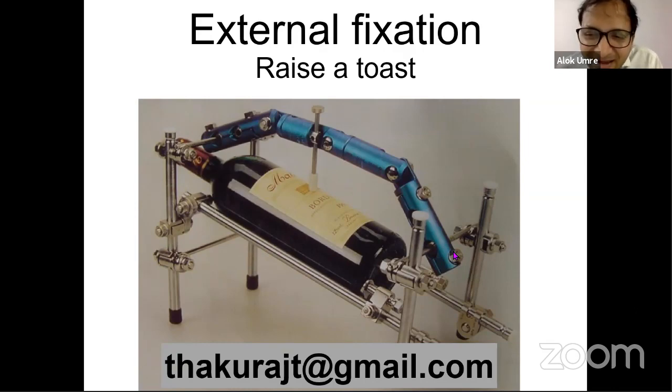Sir, can you shed some light on the complications in external fixator? Yeah, there are a number of complications, right from the pin tract infection, etc. But during the surgery, the complication which can occur is injury to the vital structures, which although the percentage is very, very low, the injury does occur, and therefore one should be very thorough with the anatomy of the limb in that area to avoid injury to the neurovascular structures.